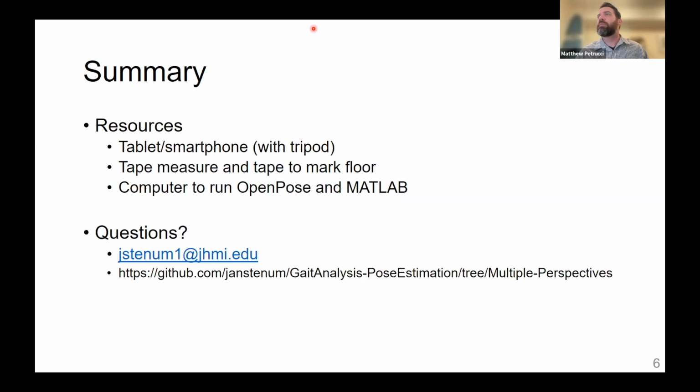So just going back to the questions, a question from Andreas Bortanis. Have you thought about trying to calculate three-dimensional movement from the single views in either case, or maybe combining the two cameras together? At this stage, we've thought about it, but it's not something that we have pursued so far.